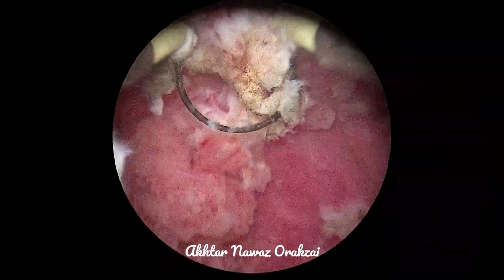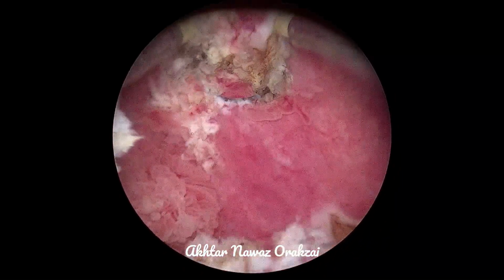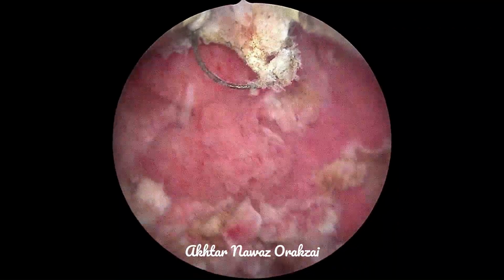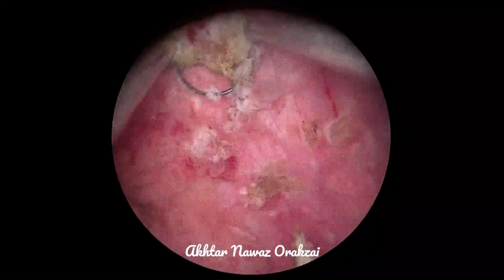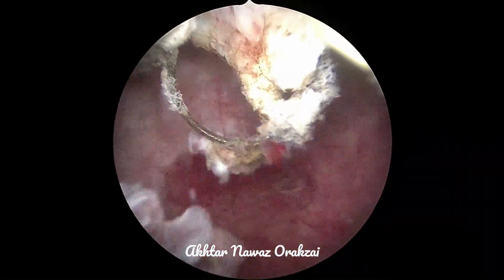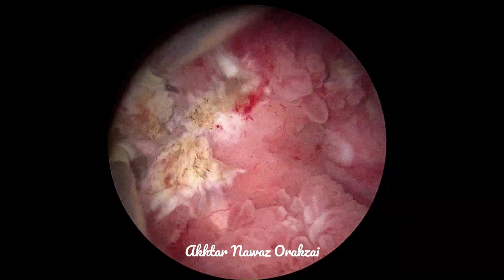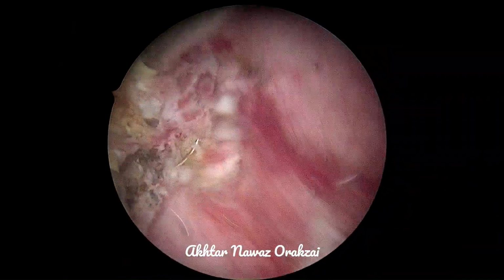We are going in the retrograde fashion because it is on a very dangerous location. If we go a little deep, we may perforate the dome. So you can see from the diathermy that we are applying the diathermy in pulses and not continuously, to avoid any perforations in the urinary bladder, which is harboring a recurrent papillary tumor, multiple in number, in a young patient who is 24 years old.